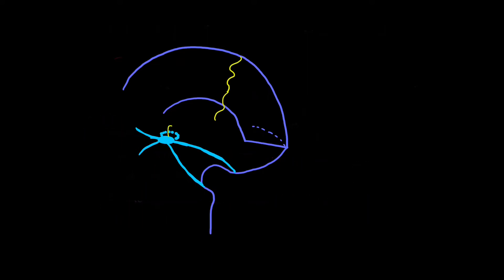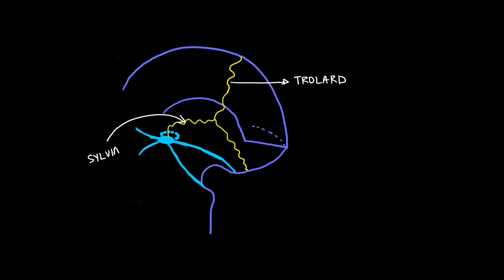Now we are going to see the three named cortical veins. These anastomose with each other and connect to the dural venous sinuses. The vein of Trolard is across the parietal lobe; the vein of Sylvian and vein of Labbé are also shown. The vein of Trolard drains into the superior sagittal sinus. The sylvian vein drains into the cavernous sinus, and Labbé drains into the transverse sinus. They anastomose with each other on the cortical surface along with other unnamed cortical veins.